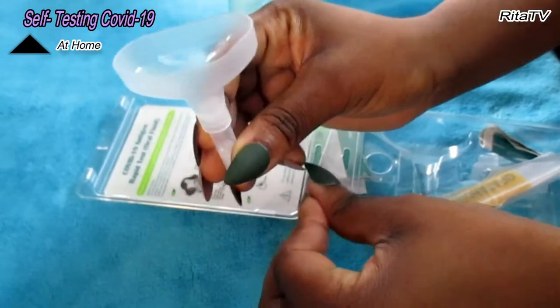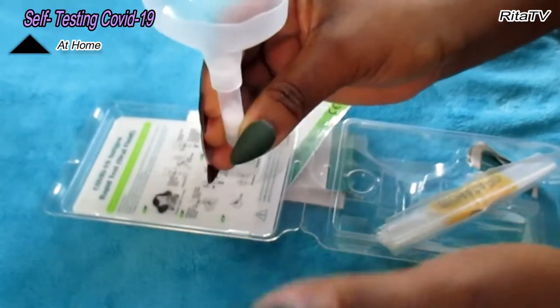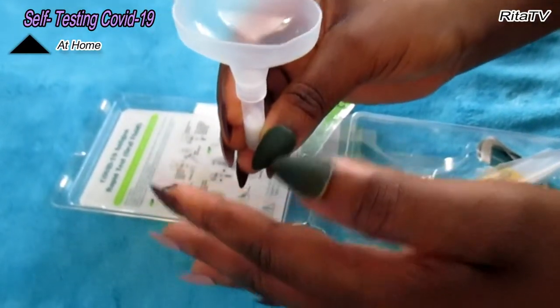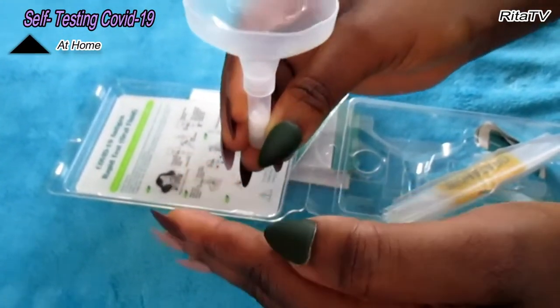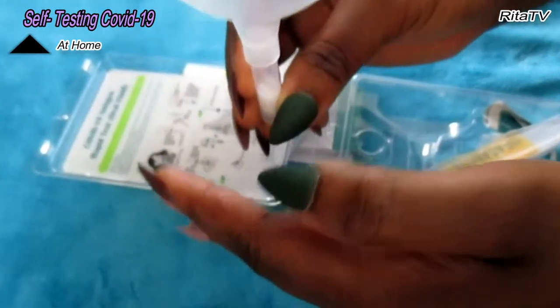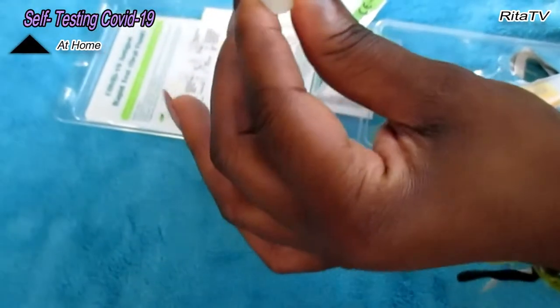So before I forget, before you can do this test, you don't have to eat anything. So I'm doing it in the morning. I've not eaten anything, and you don't have to take any alcohol. You don't need to take any water or anything. You just do it straight. So this is how it looks like, and I tried to put the spit inside.